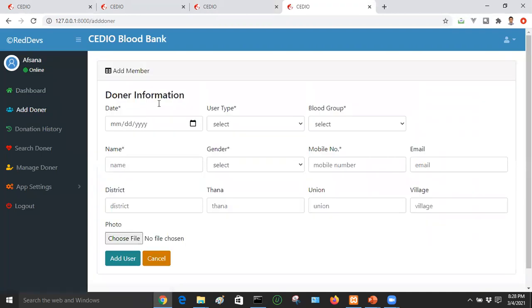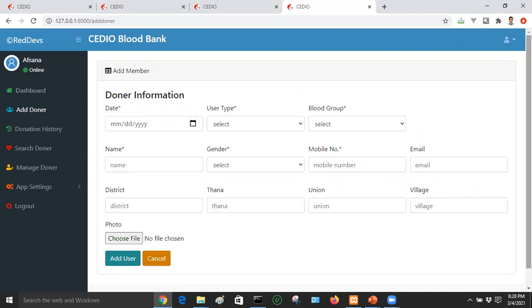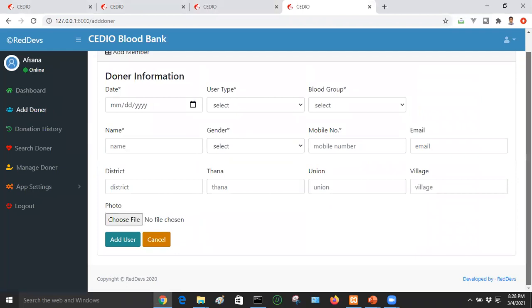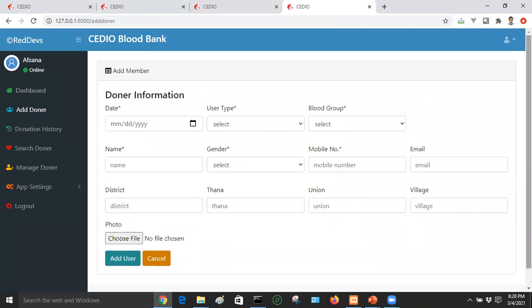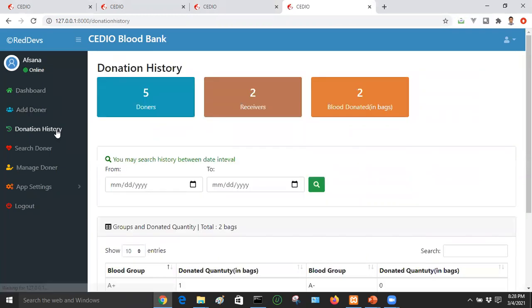If you click on 'Add Donor', you can click on the add donor button, submit the form, and upload a photo of the donor — the donor is then added. Click on the donation history of the donor to view it. There are donors listed in the system.